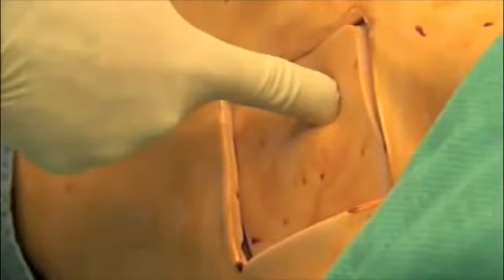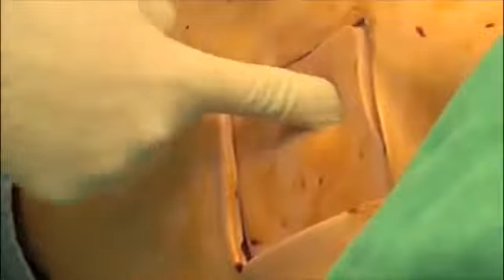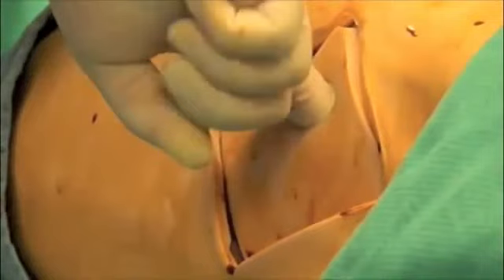Place gloved finger into the incision to verify that the pleura has been entered and to clear any adhesions, clots, etc. The finger should sweep completely around the incision.